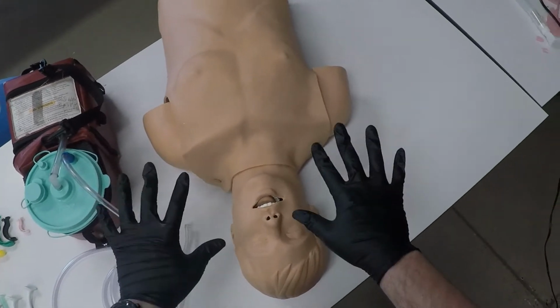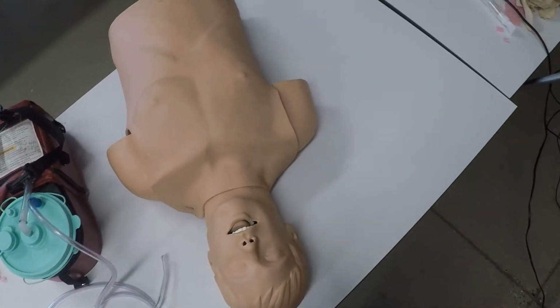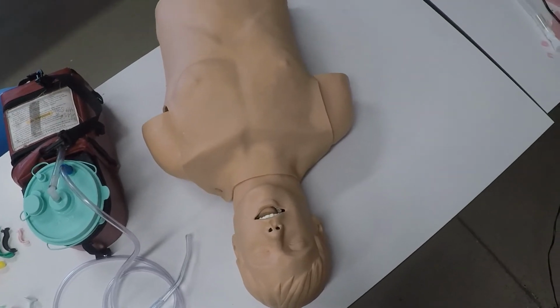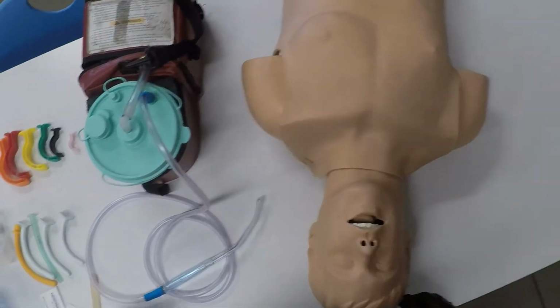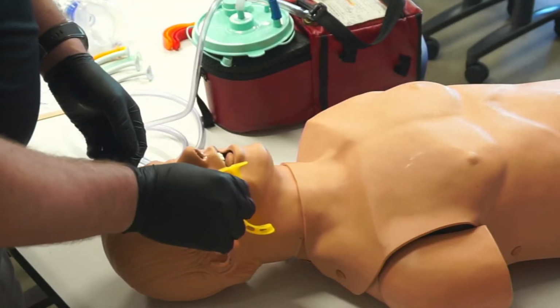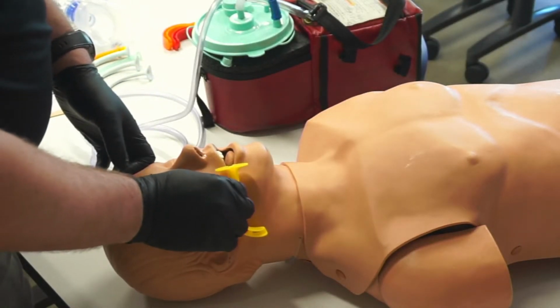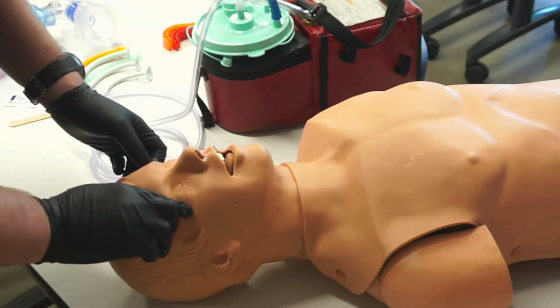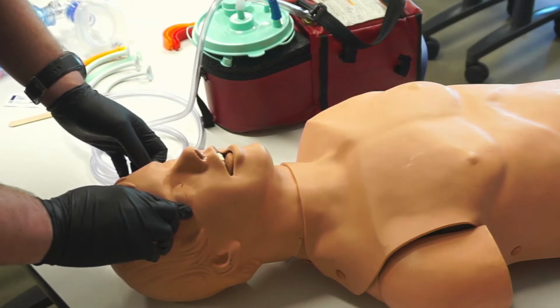My scene is safe. I have my BSI on. I have an adult patient who needs airway support. I am going to select an OPA, confirm that it is the correct size by measuring from the corner of the mouth to the angle of the jaw. I am going to check this patient for a gag reflex with an eyelash flutter test.